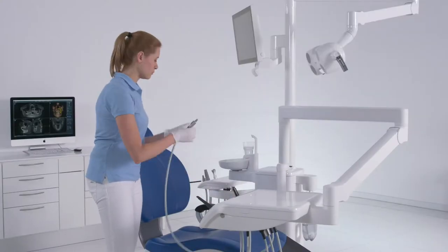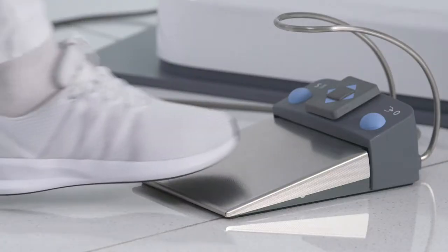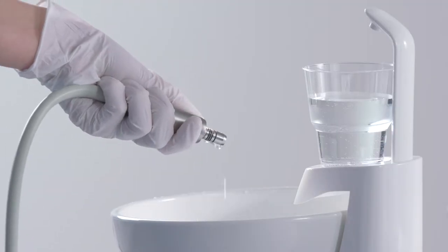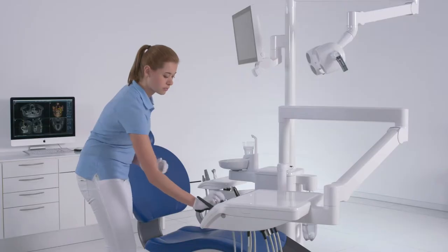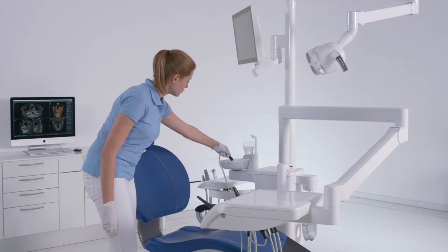Remove a single instrument and hold it over the cuspidor. Briefly press the foot control. The removed instrument will be flushed with Dentosept S for about 15 seconds. The flushing will stop automatically. Repeat the procedure for all other instruments.